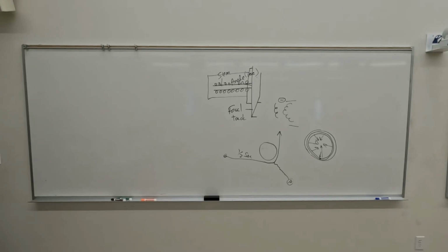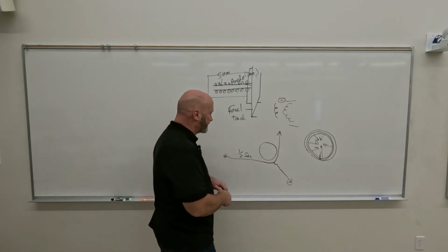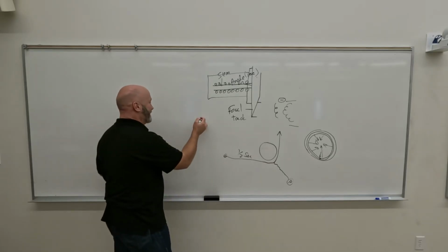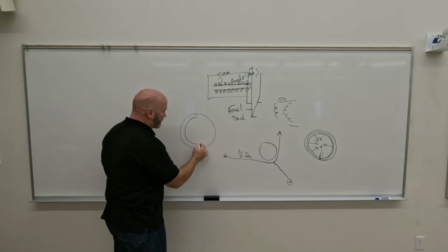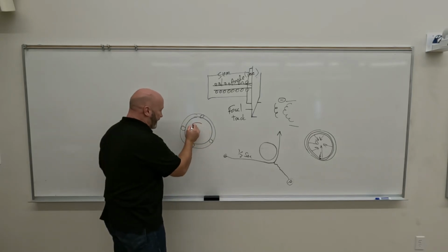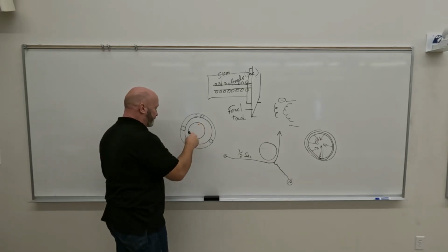All right, so rotation of anode, high capacity induction motor outside the tube, electromagnets, fire. Oh, yeah, okay. All right, so I need my induction motor back. So we've got our induction motor with the electromagnets, in different places. We've got our anode. We've got the ferromagnetic material inside of it.